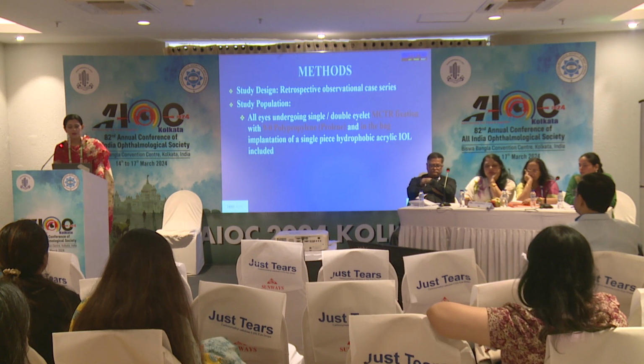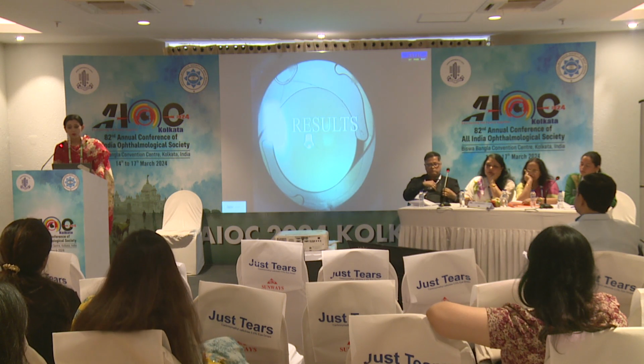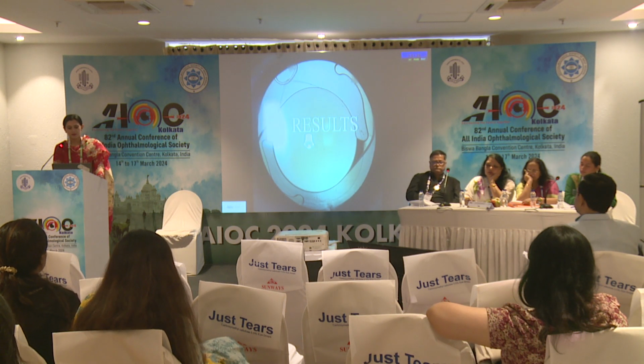This was a retrospective observational case series, and all eyes underwent an MCTR fixation using a 9-0 Prolene. Subluxations of any etiology were included, and only those cases were analyzed where we had at least 5 years of post-operative data. So, looking at the results, what did we see?